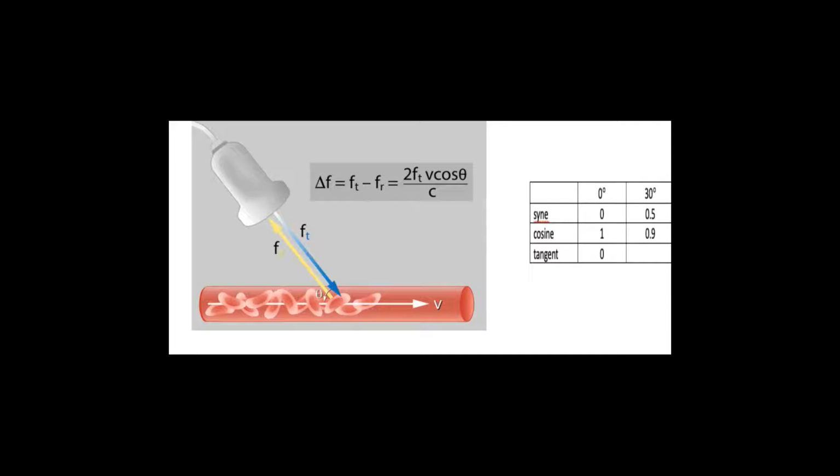Second, it is also a matter of trial and error, because sometimes you don't know exactly when and how you are going to strike parallel alignment. Therefore, you have to interrogate many windows.